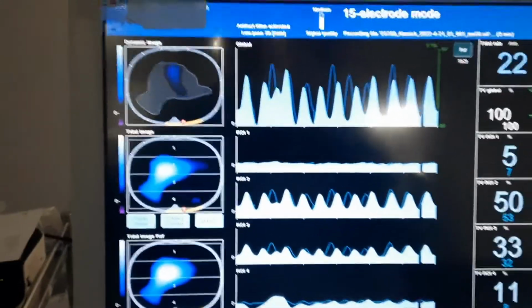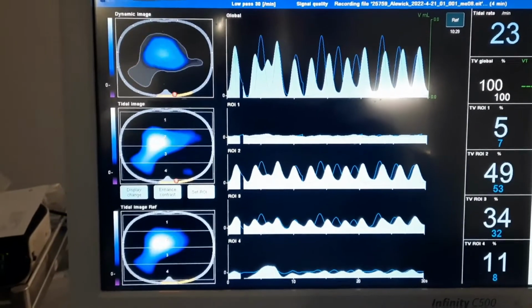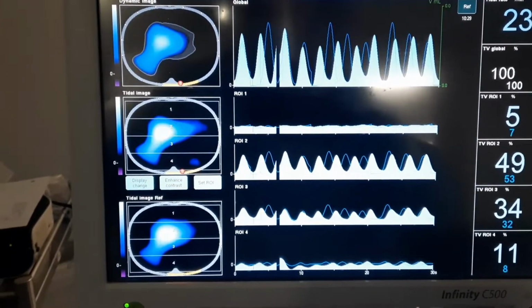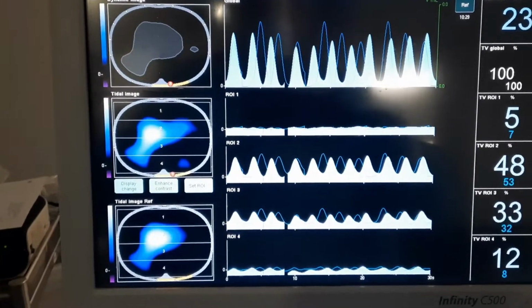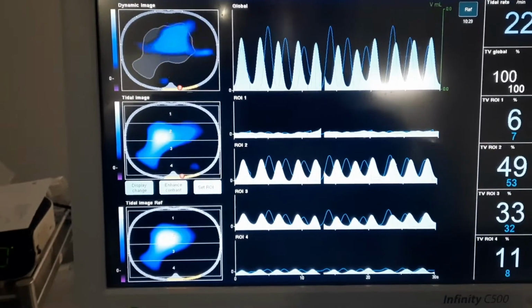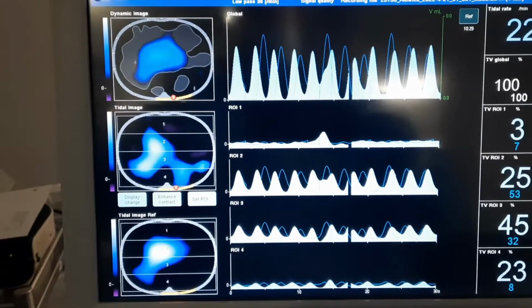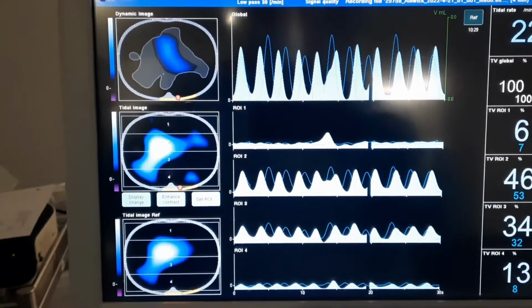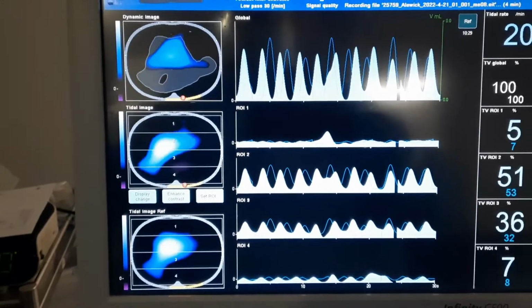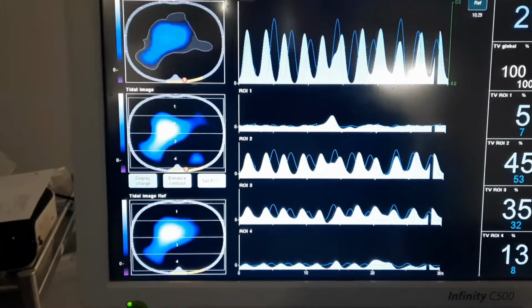So this is a patient that is on OptiFlow. We're trying to wean the patient off of the ventilator. So we're going to put the patient back on the ventilator now that we have the reference with the OptiFlow. And we're going to find the parameters on conventional mode, and we'll try APRV also and see which one recovers all of the lung recruitment so that the patient, when they're going back on the vent, is properly rested and optimized for the next OptiFlow trial.